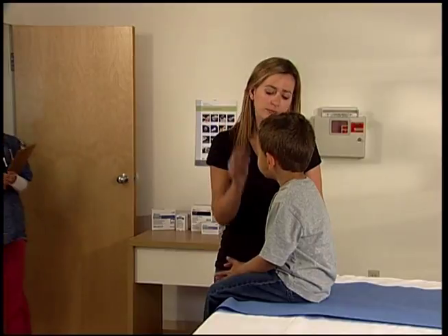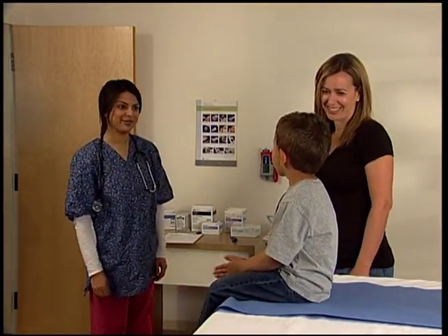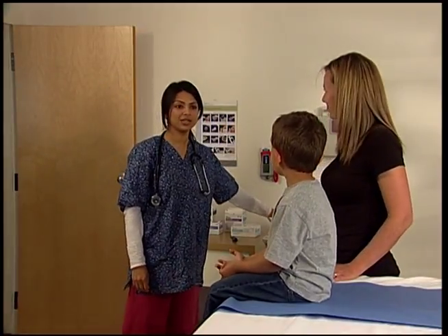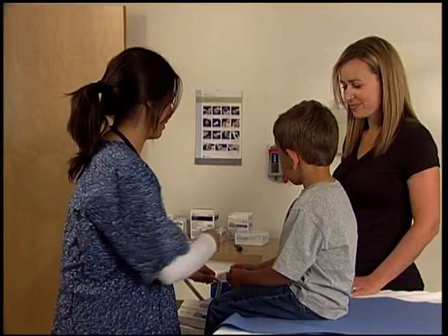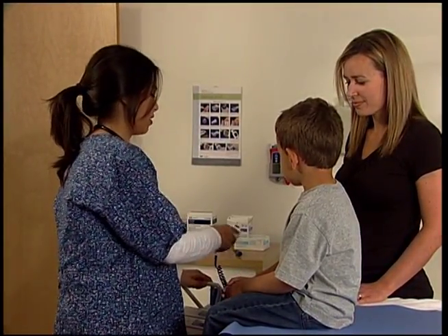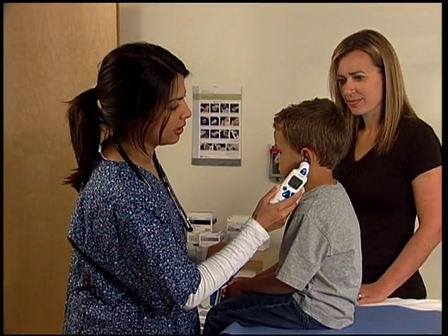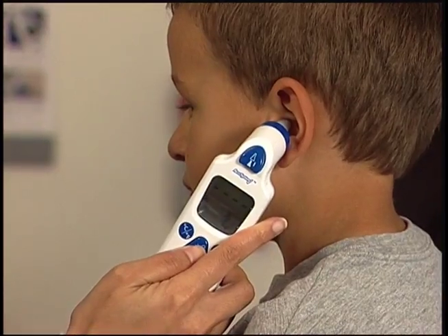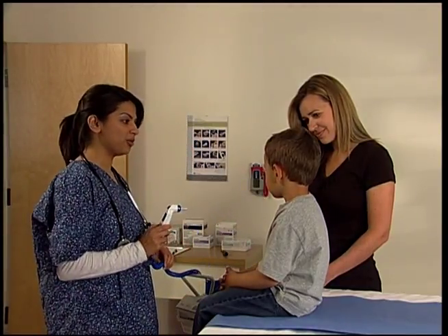For the pediatric population, the tapered probe tip design enables the Genius 2 thermometer to easily fit into and align with the pediatric ear canal. Apply only gentle pressure for children and especially infants to avoid compressing the very soft tissue in the ear, blocking infrared energy from reaching the probe tip. Once seated in or over the ear canal, press the scan button to take your reading. Discard the probe cover once you have completed the reading.